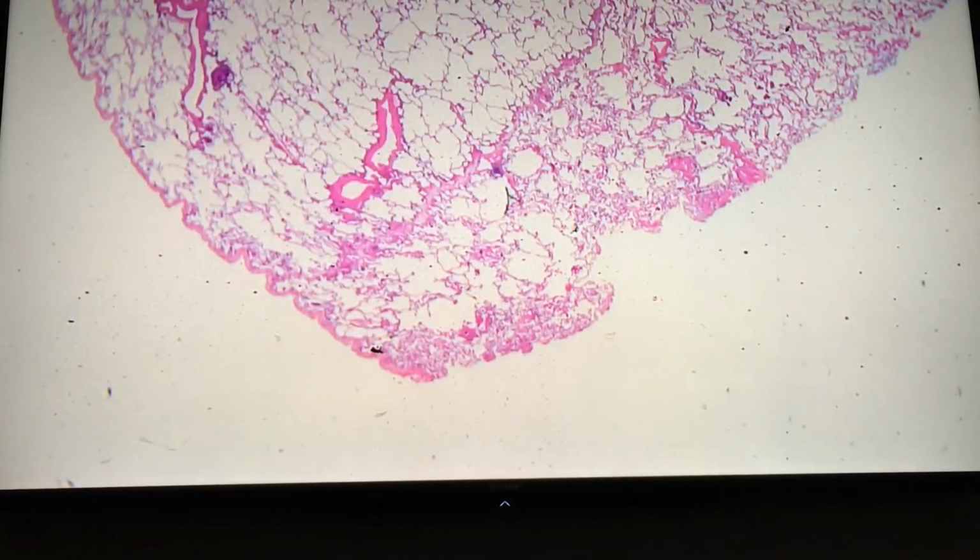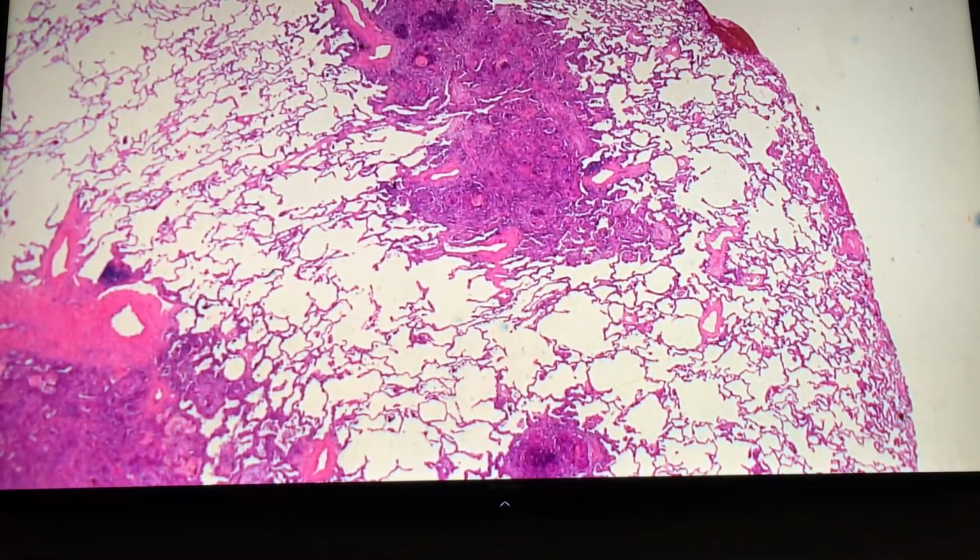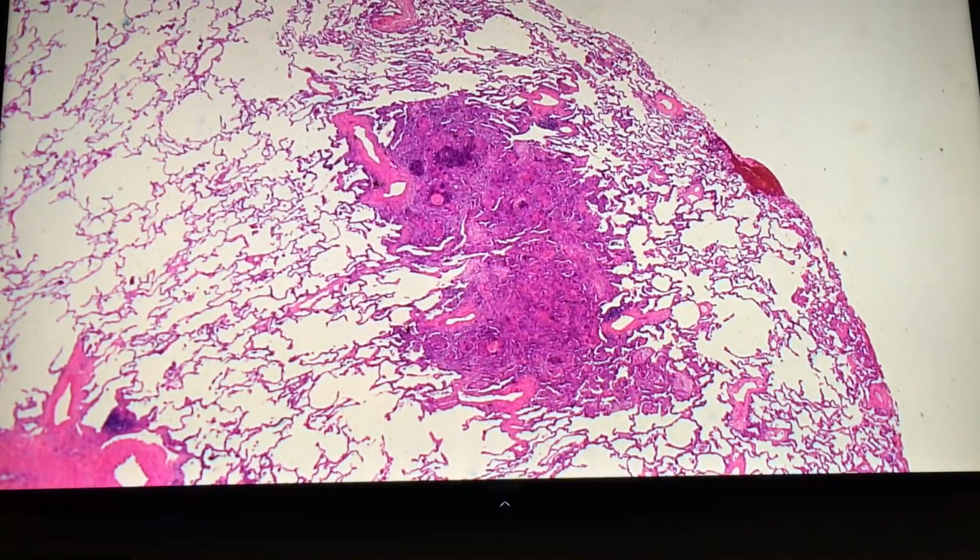Okay, I want to show you one. Let's do one more and then I'll show you one special case. Ooh, this is beautiful. I know what this is from low mag. So there is something here about the distribution. Just leave it here for a second.